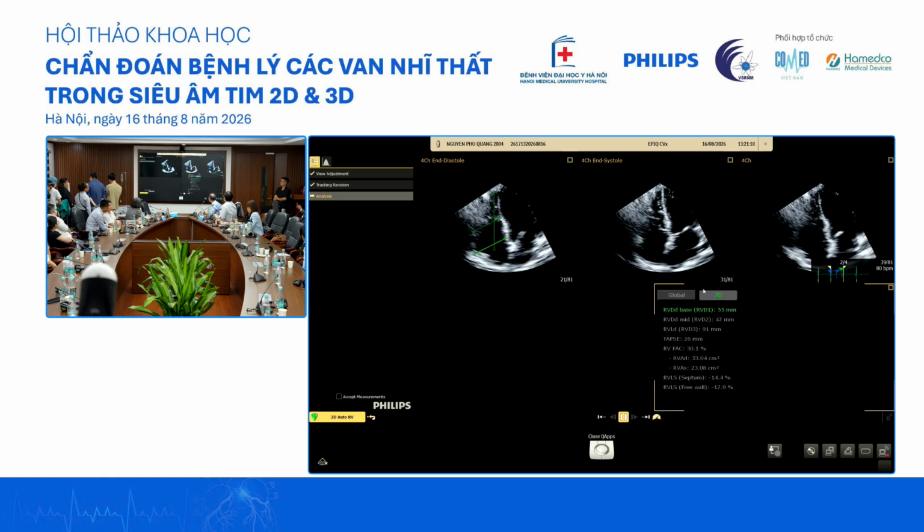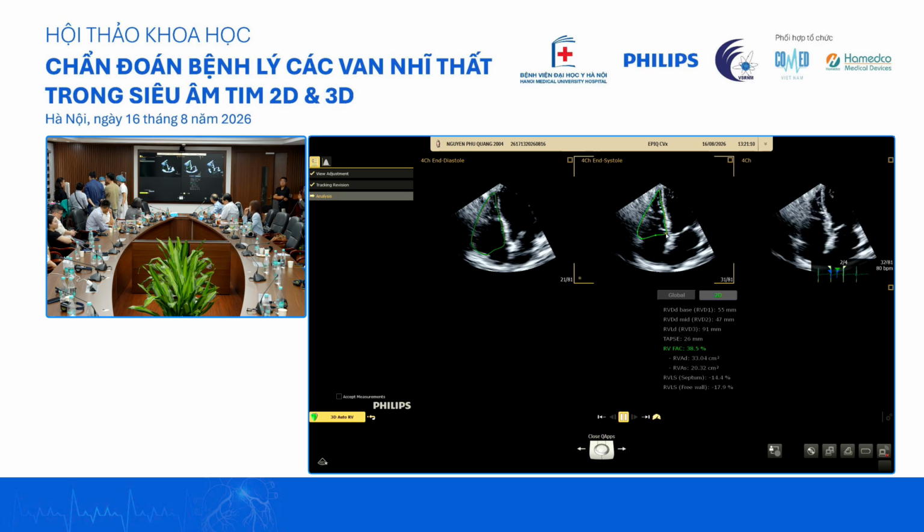So these are some of the adjustments that you can make in case you feel that it's not tracking well. I think you can still adjust it a little because you see it's not tracking as well. Some minor adjustments.